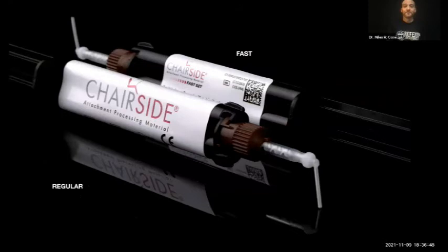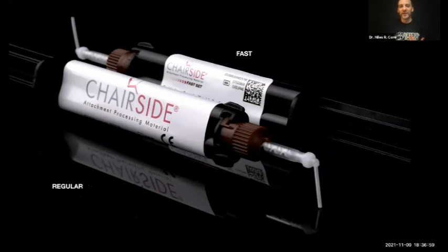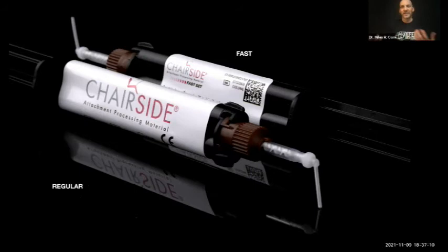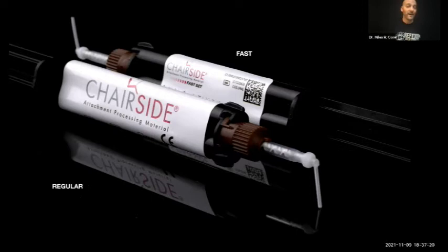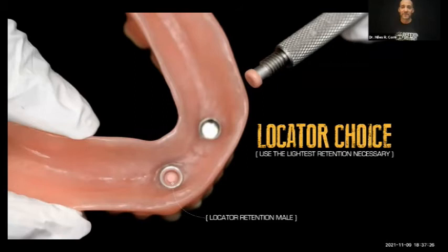This is another type of pickup material — I prefer ones that come in little syringes, almost like composite. There are different types; as a prosthodontist I need to move quick, so I like fast-setting pickup resins. Use whatever you're comfortable with — please don't use the fast-setting one just because I use it and get stuck halfway through, unable to seat it. When you get to picking up the locator attachments, I really highly recommend using the lightest retention possible. I know everyone wants to go to the strongest retention, but please make certain your patient can actually take it out at the end of the day.